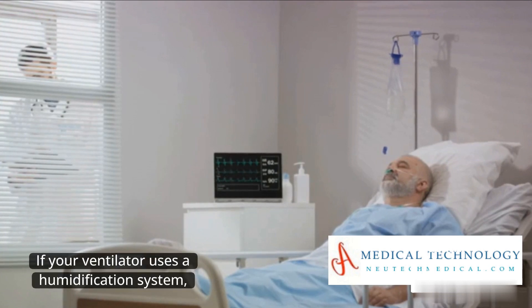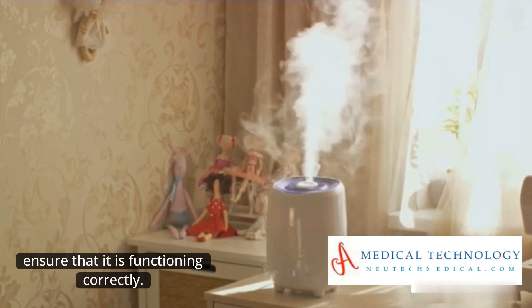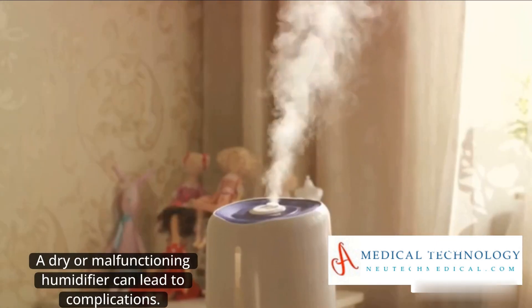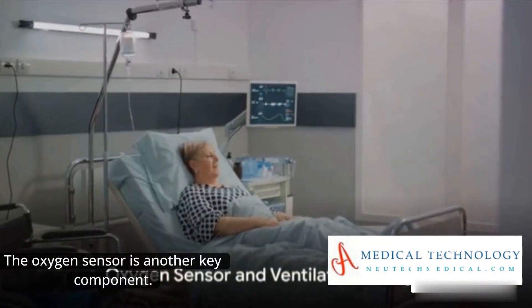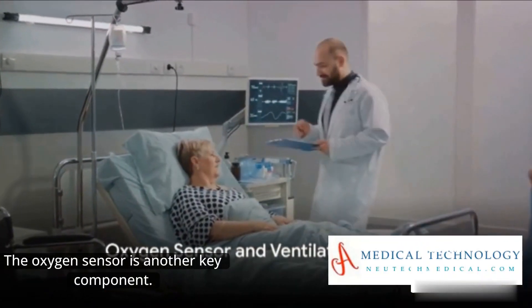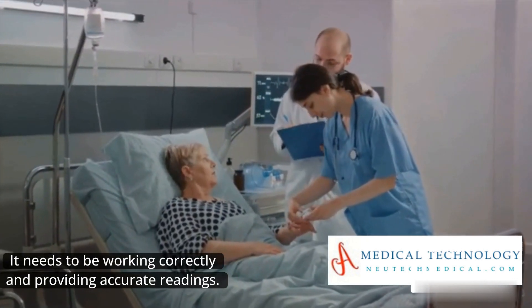If your ventilator uses a humidification system, ensure that it is functioning correctly. A dry or malfunctioning humidifier can lead to complications. The oxygen sensor is another key component — it needs to be working correctly and providing accurate readings.